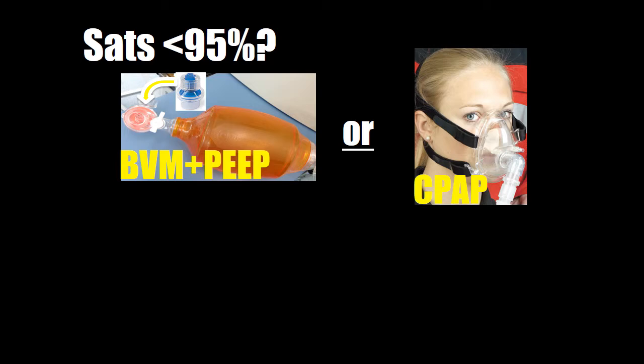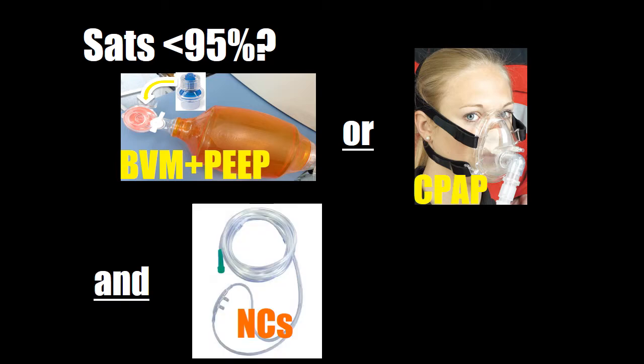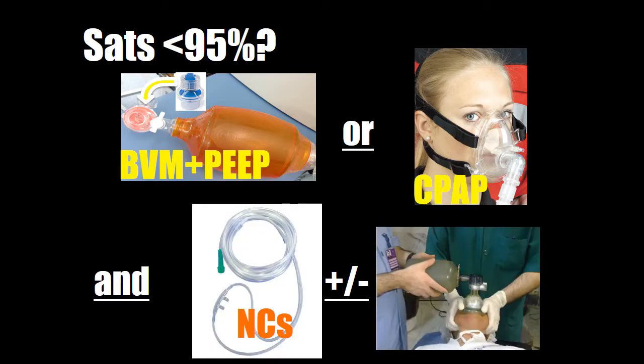Now, it's really important, if you're using the bag valve mask with the PEEP valve to deliver CPAP, you have to have nasal cannulae underneath, because there is no fresh gas flow to the mask with the bag valve mask and PEEP. You need the nasal cannulae underneath to generate fresh gas flow and therefore generate pressure. So without the nasal cannulae underneath, the BVM and PEEP system becomes completely redundant for delivering CPAP. And it doesn't deliver the CPAP that you dial up. It'll get somewhere close to it in expiration, but in inspiration, your pressures will actually be lower. So your mean airway pressure is going to be lower than what you'd be getting if you're using CPAP. So it's a poor man's trick, really, if you don't have easy access to CPAP or the ventilator.